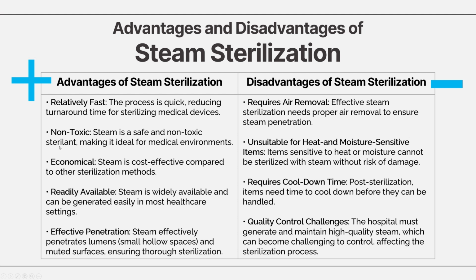Non-toxic. So steam only uses water, right? So it's non-toxic. It leaves no harmful residues on instruments, making it safe for patients and staff. Unlike certain chemical sterilants like ETO or even hydrogen peroxide, in comparison, because it's just using water, it's much safer.